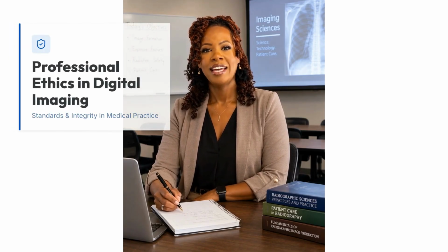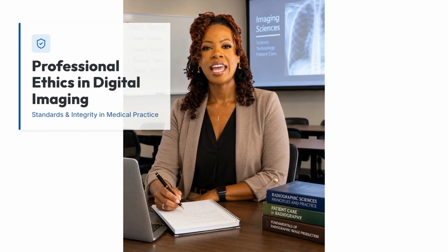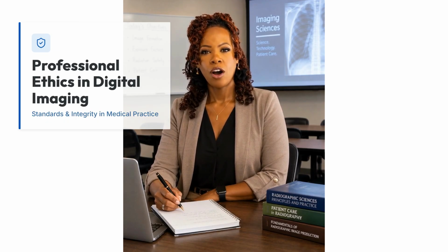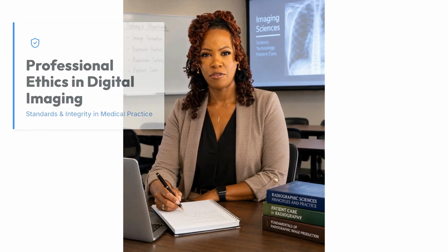And most importantly, we must discuss the ethical responsibility associated with post-processing. Digital radiography gives us powerful tools to modify how an image is displayed. We can adjust brightness and contrast, apply edge enhancement, use electronic masking, and crop an image. These tools should be used to improve visualization of the acquired information, not to misrepresent what was actually captured. The radiographer should never manipulate an image in a way that adds, removes, conceals, or misrepresents clinically significant information.